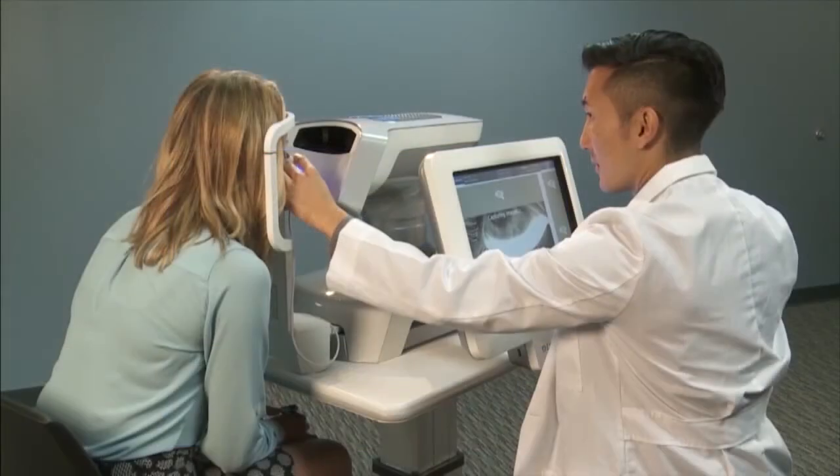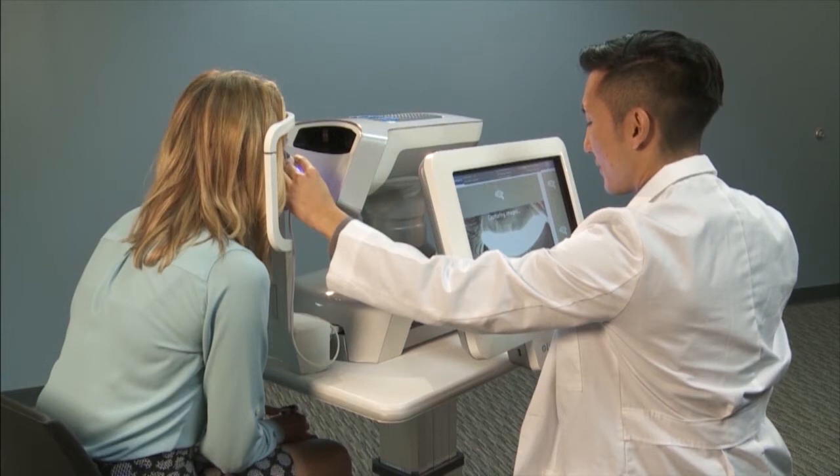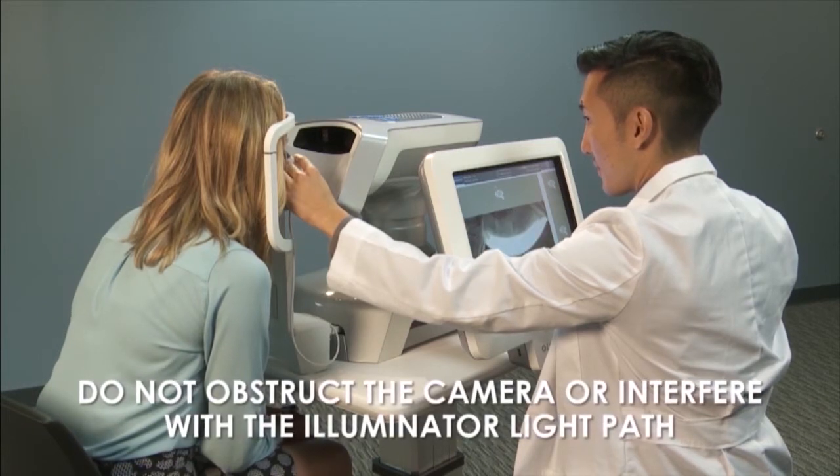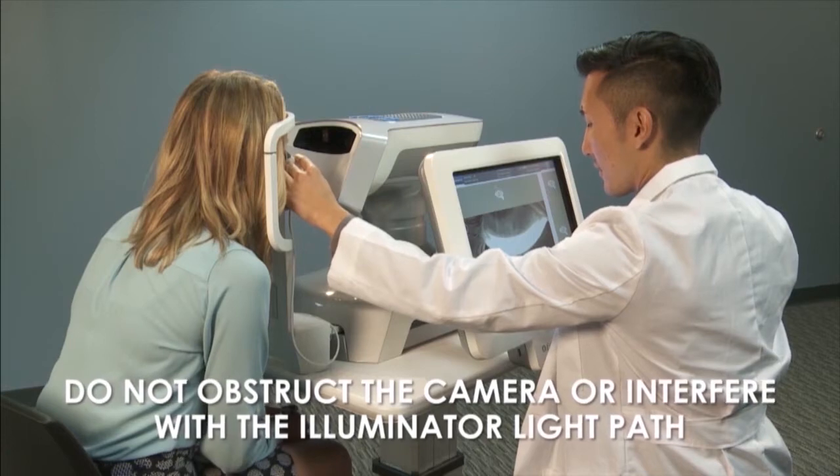For optimal image quality, it is important that the patient and operator remain still until the image capture is complete. Make sure that the operator's hand does not obstruct the lid, block the camera, or interfere with the illuminator's light path.